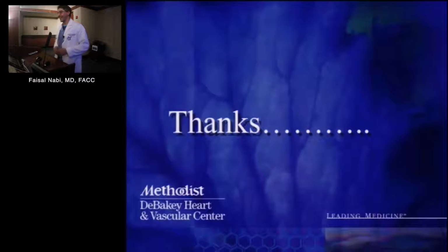Okay. Give me one. I'll tell you what. CMR is inherently a longer test. It will take an hour. If you need a quick answer, go with CT. If you're looking for a malignant mass and you need to know tissue characteristics, especially if it's in the heart, then CMR will assess those things.